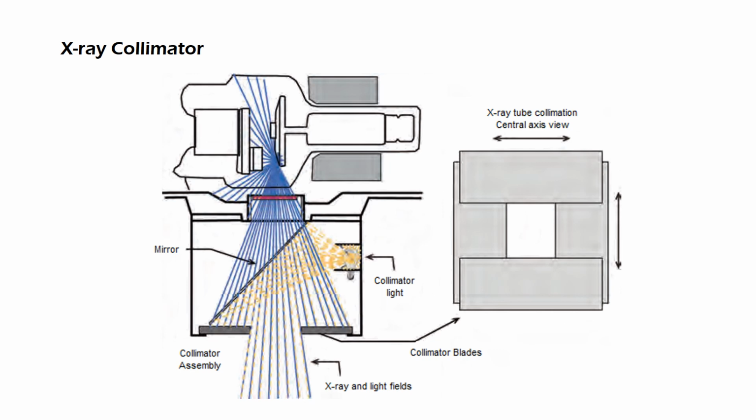With this we conclude the first part of the tutorial on the different components of the X-ray tube, their structures and functions. In the second part we will discuss X-ray tube rating and common faults in X-ray tube.